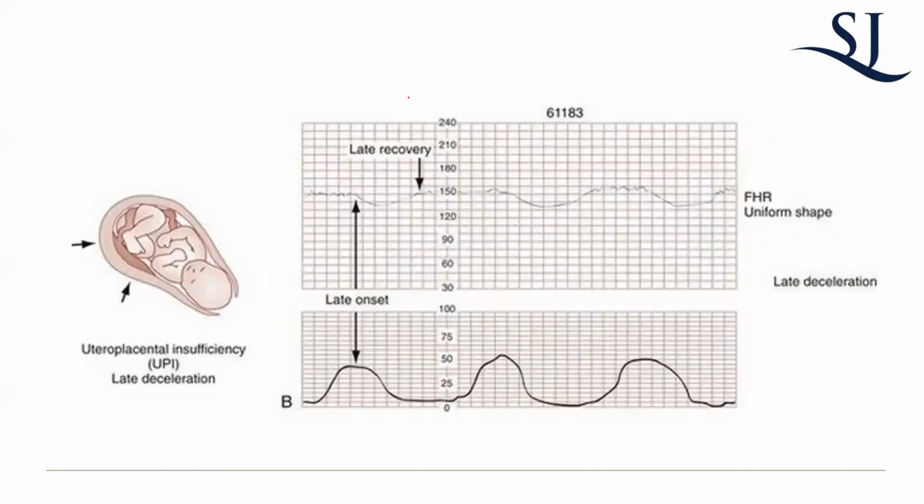Now, a late deceleration is when the peak of your contraction is when your late deceleration begins. Okay.